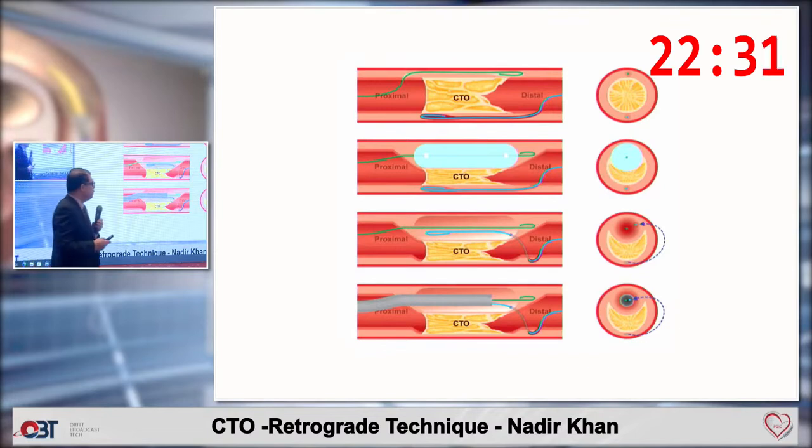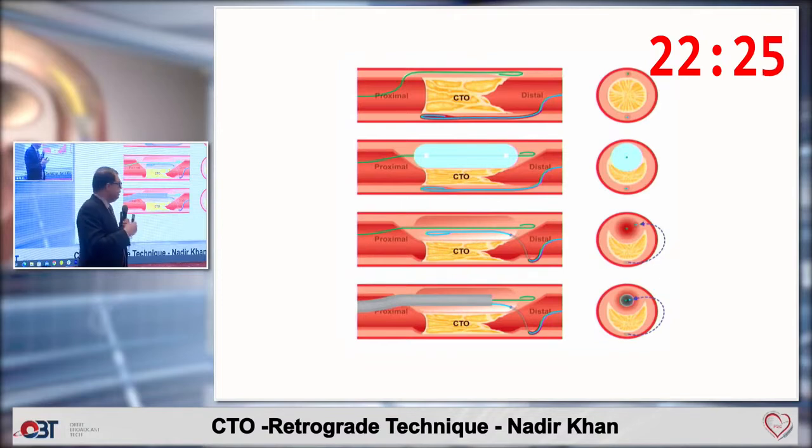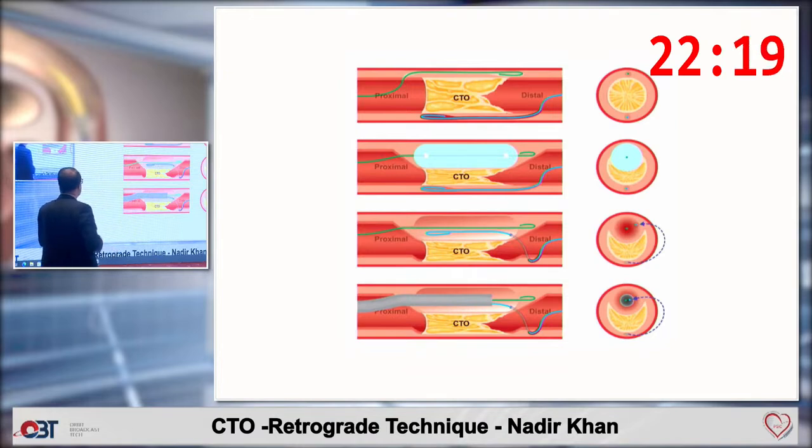Before doing that, you need to be sure in two orthogonal views that both your antegrade and retrograde wires are close together. They should not be very far apart. Then you inflate an antegrade balloon and redirect your wire towards the balloon. It usually enters, and this is a guideliner which you have brought forward into the subintimal space, so this wire cannot go any place else. Once you enter here, you will also externalize the wire easily. Your microcatheter can follow in here, and then you can change to an RG3.